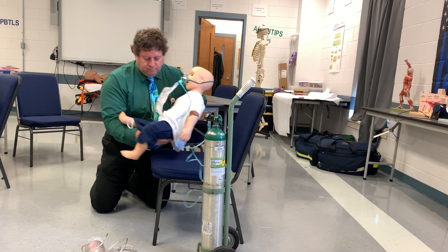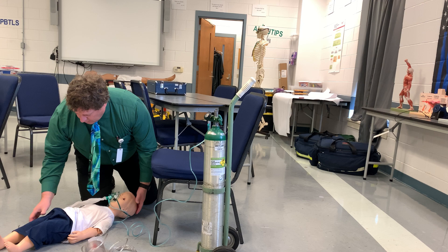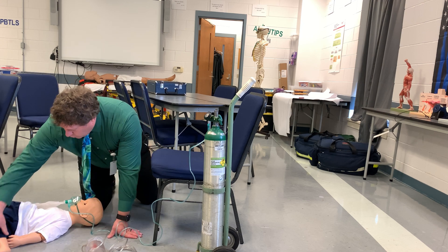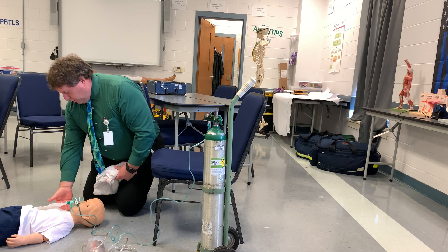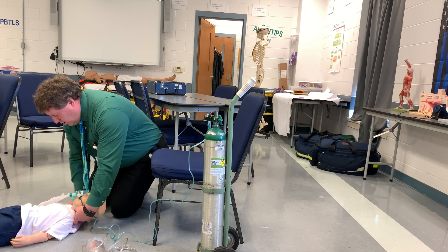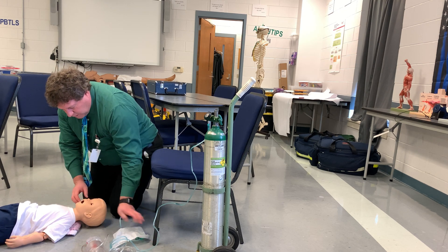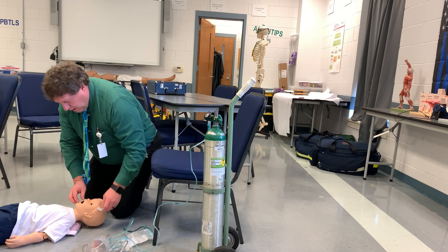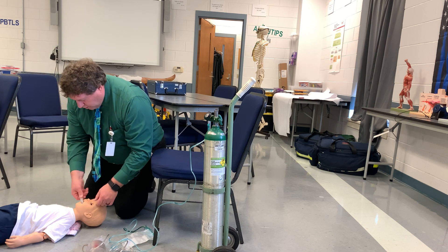I'm going to move him to the floor. To help maintain the airway, we need to pad underneath the shoulders. We're trying to get the top of the shoulders to line up with the opening of the ear, so we'll pad underneath the shoulders a little bit and that'll help open that up. Checking his airway again, making sure it's open — I think he'll tolerate an OPA, so I'll measure it, size it, and insert it.